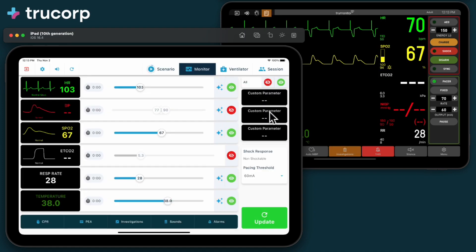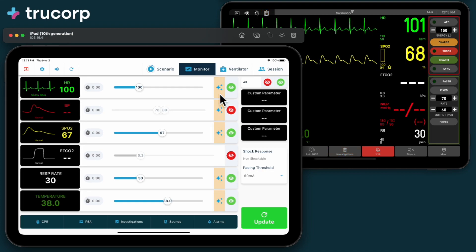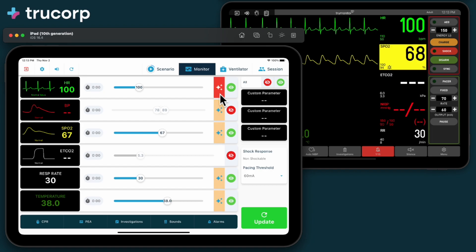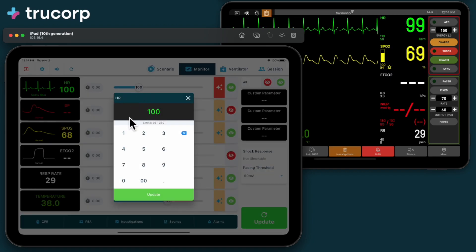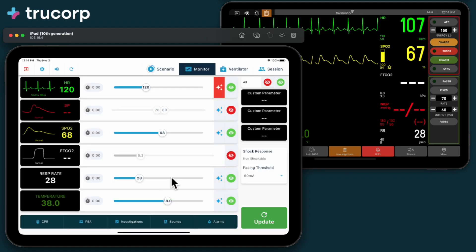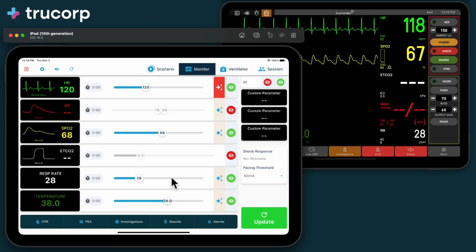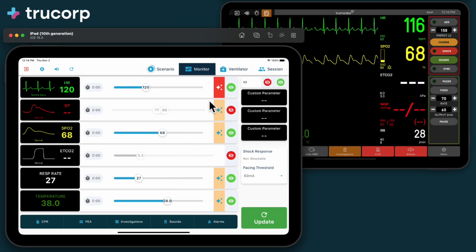Switching to the monitor tab, the flashing indicators show which values are being automatically updated by our scenario. Tapping the flashing indicator disables the automation, so you can adjust this parameter independently should you wish to do so. Any automated values are ignored while the indicator remains red. Tap again to resume automation.